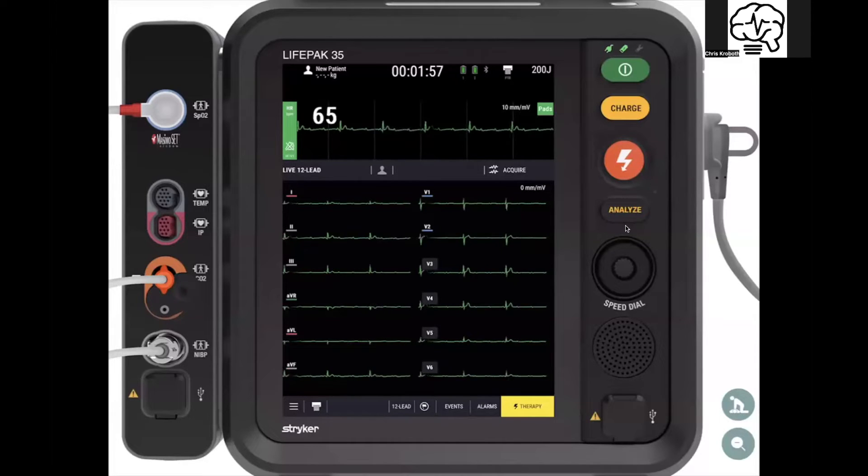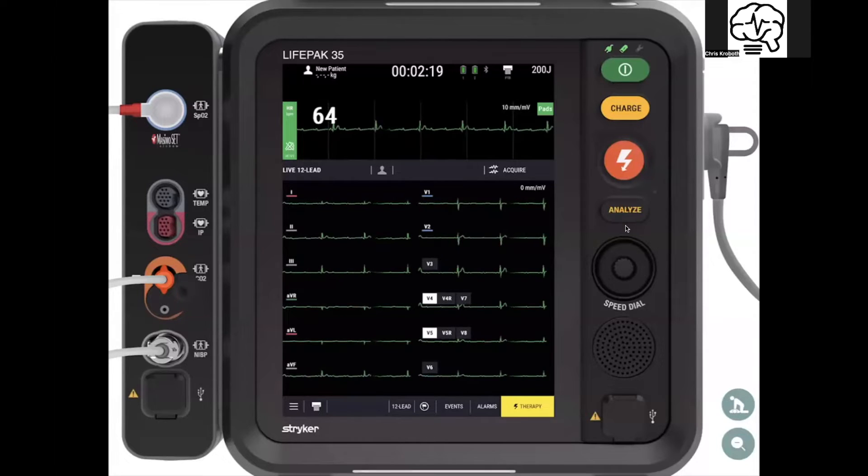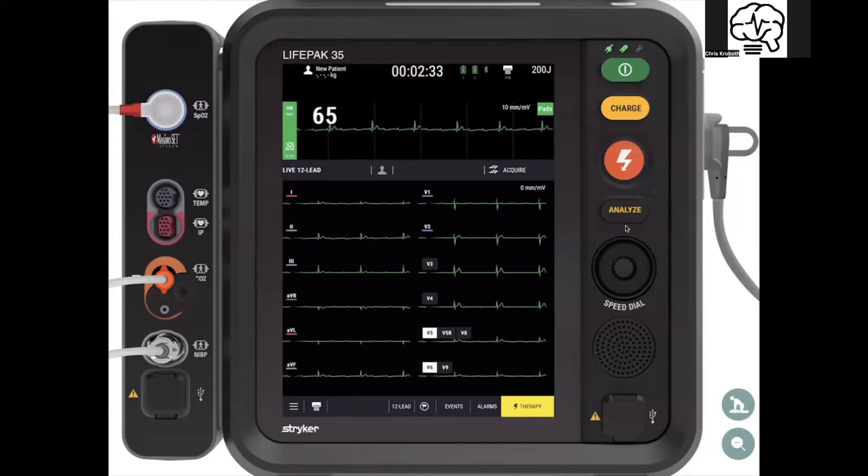The LifePack 35 has 15-lead capability — there's an extra bundle you can click onto the therapy cable, and now you can put on the remainder of the 15 leads to get a good circumferential EKG without requiring you to move them. You can go over here and relabel them. When you're acquiring the EKG, you can change the labeling, so if you're doing right-sided EKGs or posterior EKGs, you can label those out.